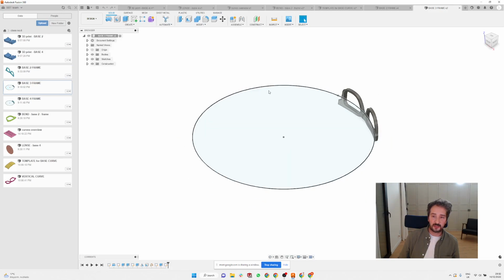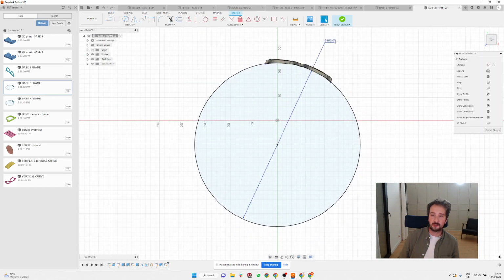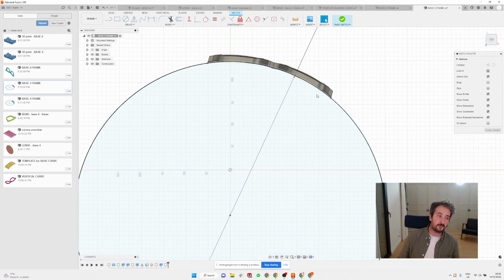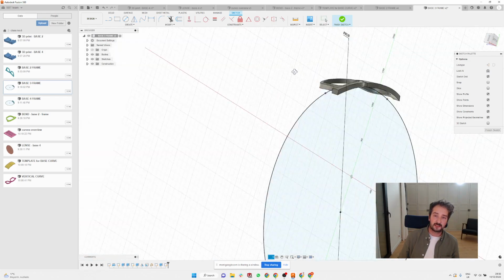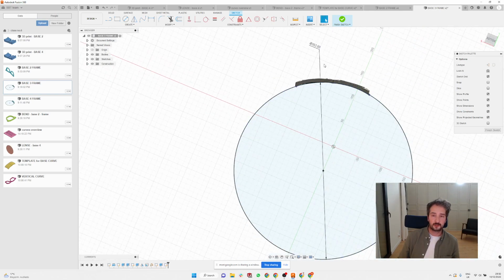I'm gonna open this one. This little circle. And double check if you put the diameter of the base curve that you want, and you can see how it's matching the frame. So if you need to make it maybe a bit more curve or a bit less, that can give you a little bit of an overview if this is correct or not.